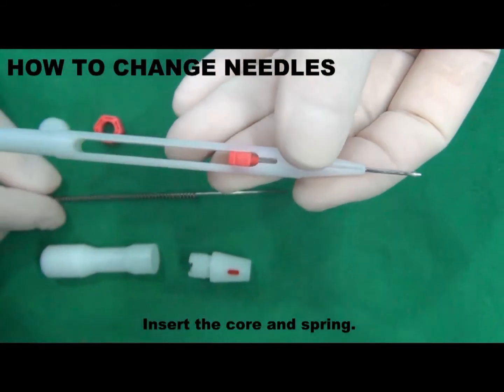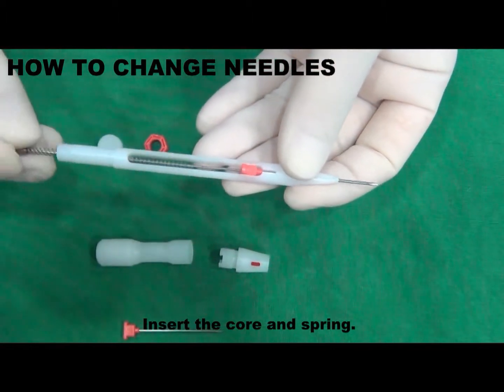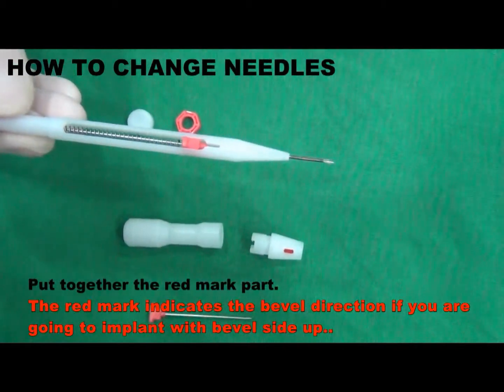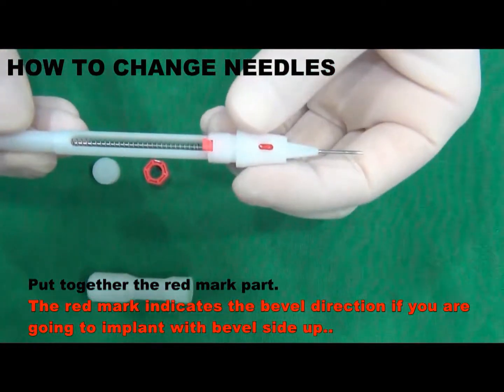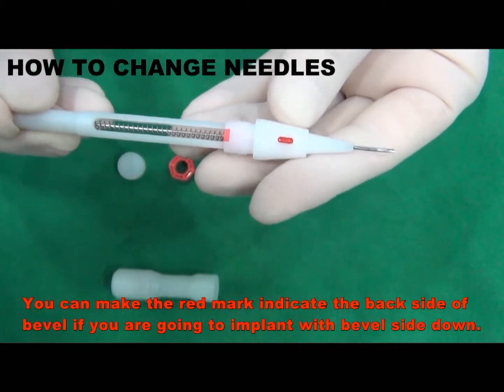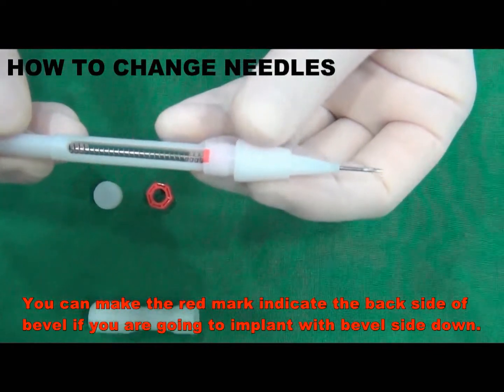Insert the core and spring. Put together the red marked part. The red mark indicates the bevel direction if you are going to implant with bevel side up. You can make the red mark indicate the back side of bevel if you are going to implant with bevel side down.